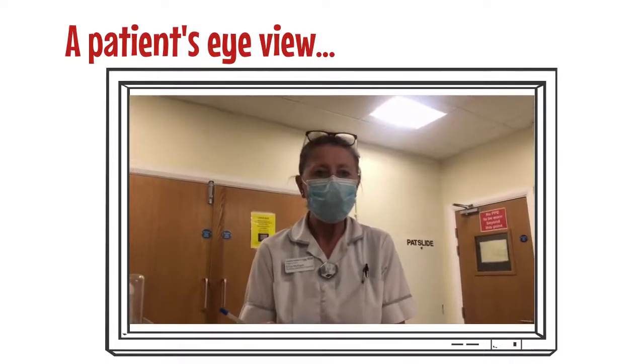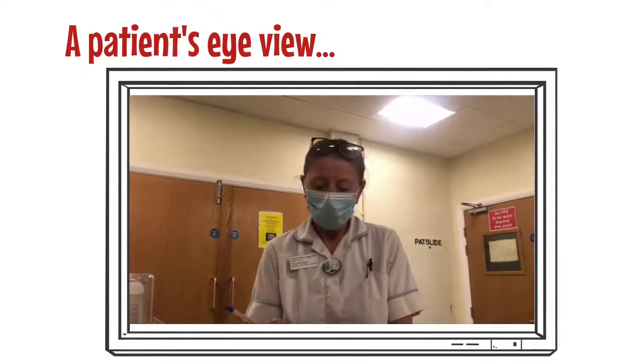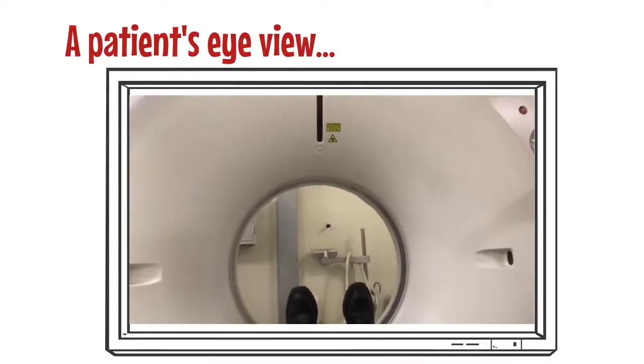You will then be asked to lie down. Once you are comfortable, the radiographer will then raise the bed and then move the bed into the scanner. I'm going to move the bed up and into the scanner, okay?